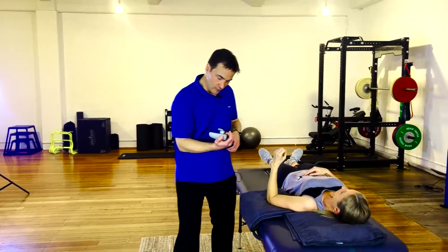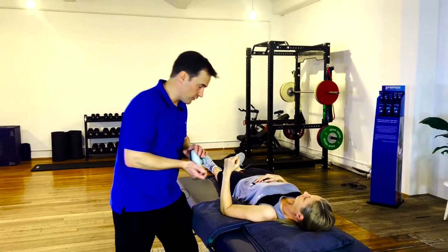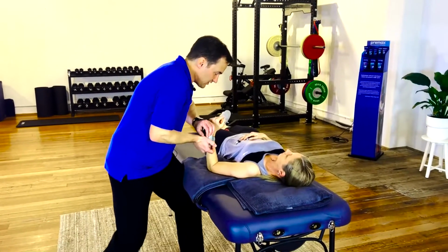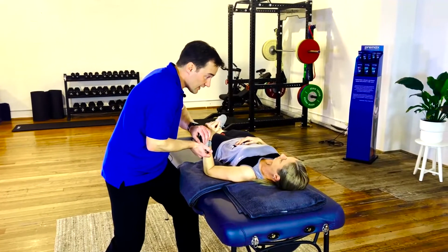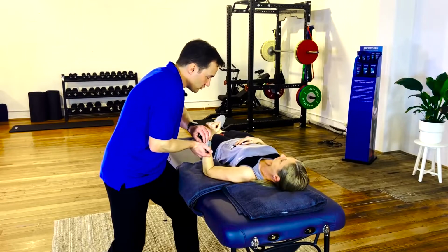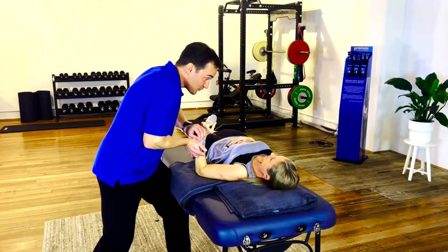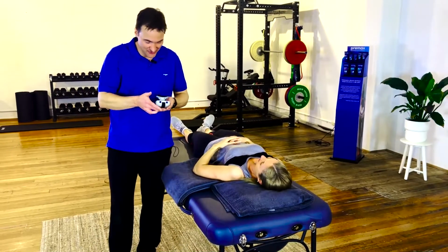Let's beat 7.9 kilograms. Of course, you could do this in newtons, or you can just convert it with a simple calculation. So we're roughly in the same spot. Same instructions. You're going to build up some force and push as hard as you can. 3, 2, 1, build it up, and push, push, come on, push, go, go, push, push, push. She looked serious enough to, I think she was trying.